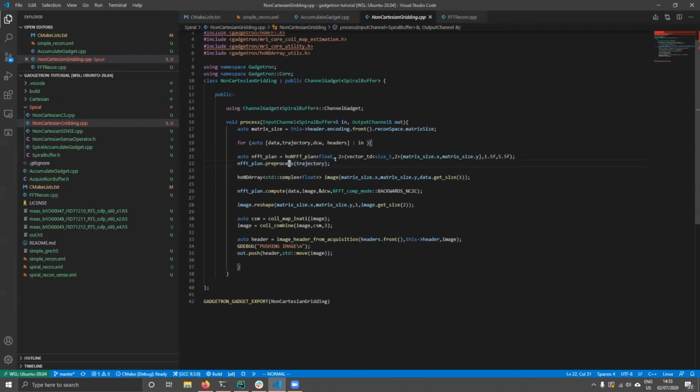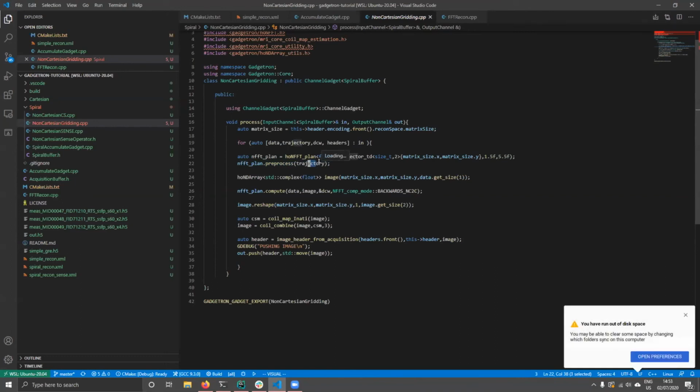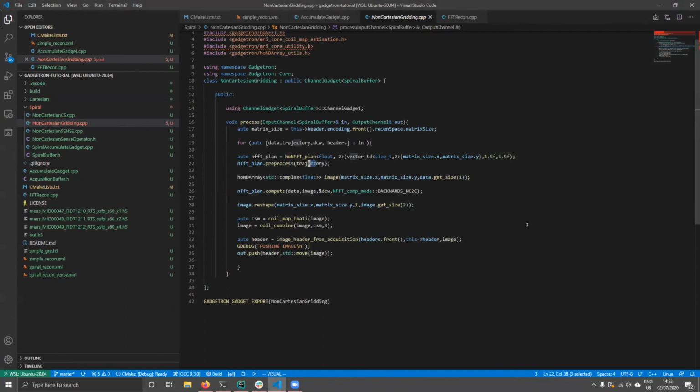And this is typically the most costly step of the gridding. It takes maybe 5 times as long as any other step. So if you can reuse the trajectory, if you're resampling the same trajectories, then that could save you a lot of time. We're not, so we can't do that. We have to create a new one for every set.